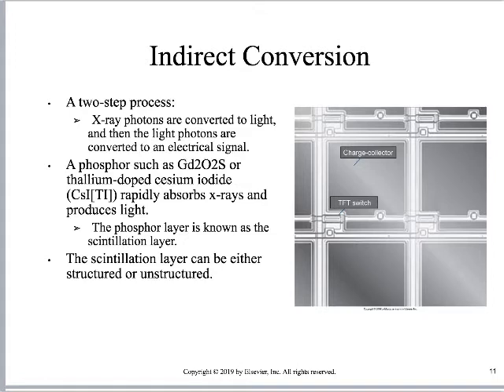And that's what we're saying when we say it can be either structured or unstructured. The gadolinium oxysulfide is unstructured. This is illustrated on page 67 in our textbook, right? So it is what was sometimes called a turbid phosphor. Gadolinium oxysulfide is turbid, right? It is unstructured, it is turbid. Those terms are interchangeable.